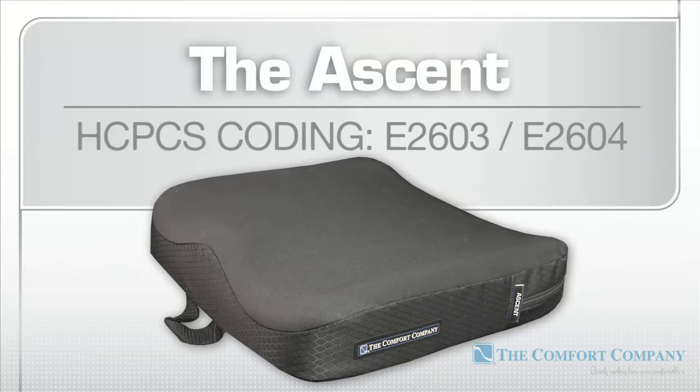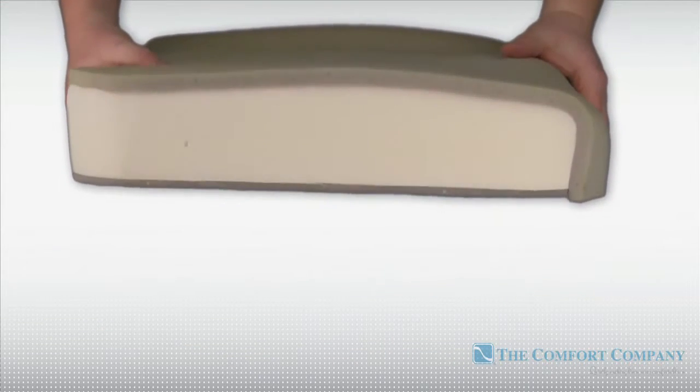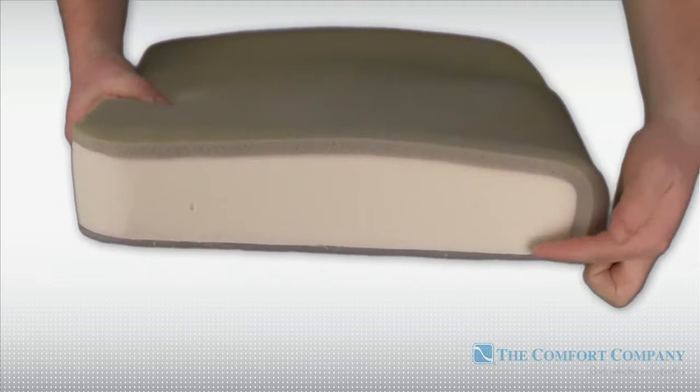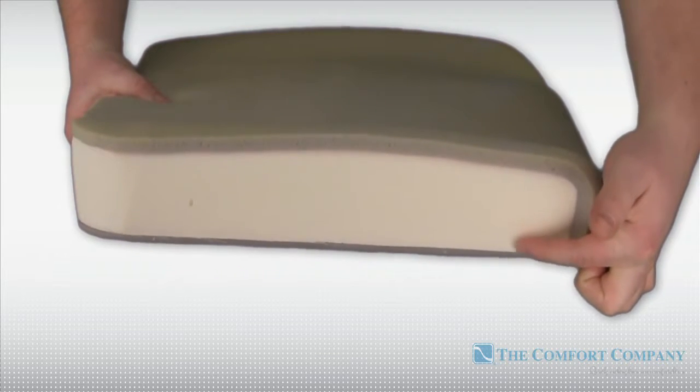The Ascent is a skin protection cushion, HCPCS codes E2603 and E2604. The Ascent utilizes three different layers of foam: a molded foam base layer for support, and a middle layer of high resilience foam for structure.